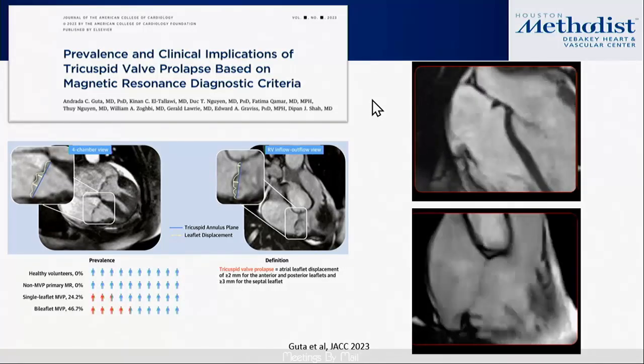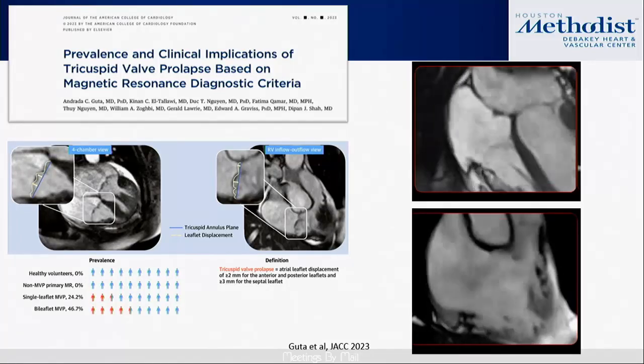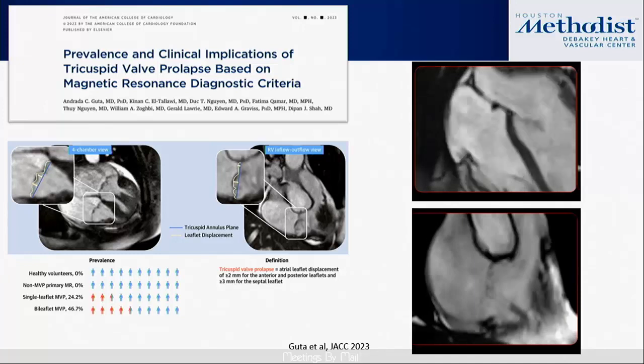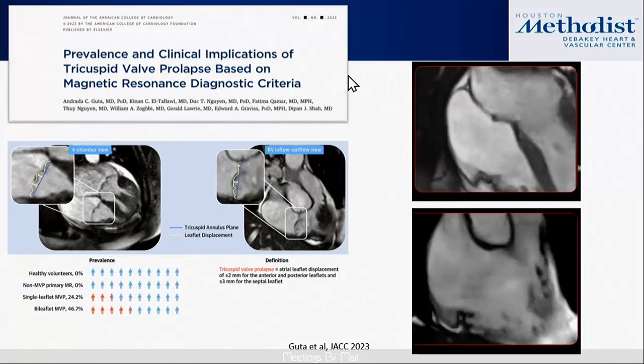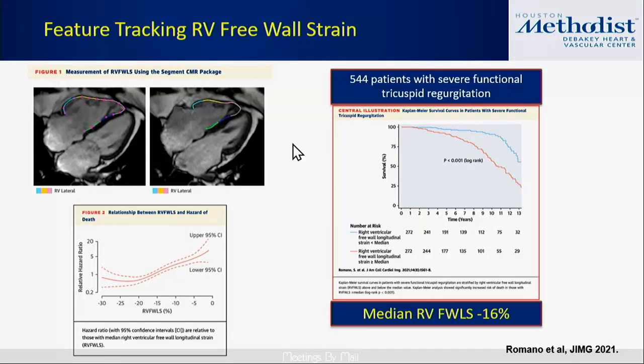And you have to figure out, how do you account for this volume? It doesn't hit the PA, doesn't truly hit the RA, but what is it? It doesn't go forward. And this is a bunch of work that looked at that, and that's important. And you really can't typically get to this other than by CMR.